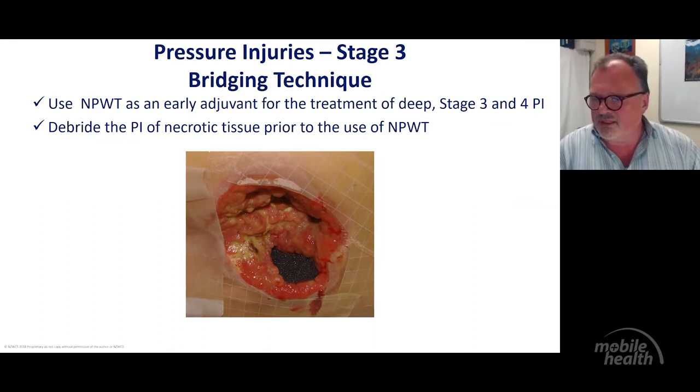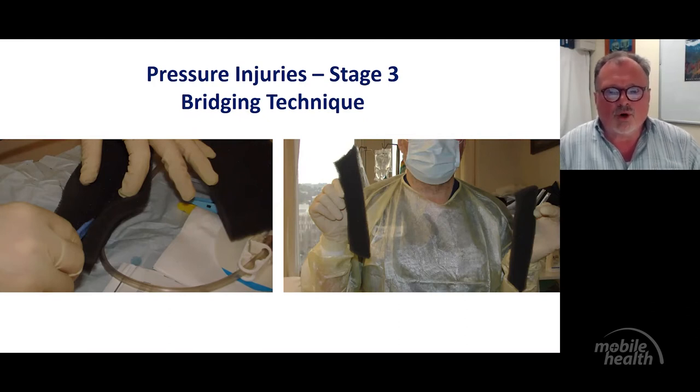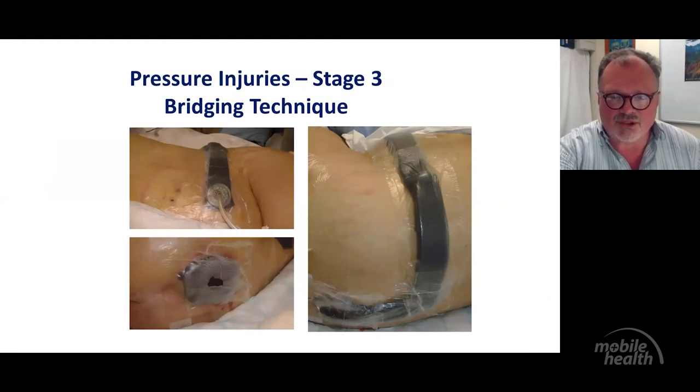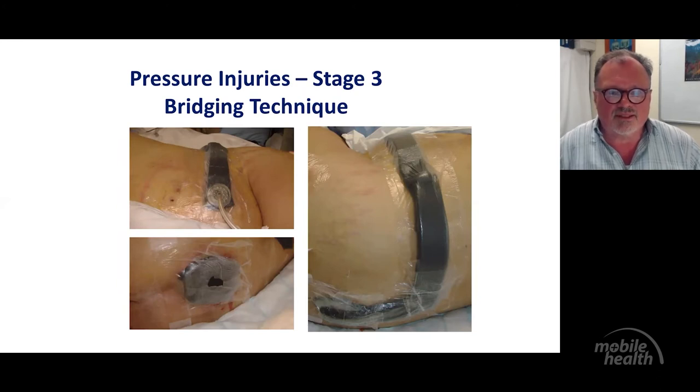So he developed nasty pressure injuries in several areas of his body. So I'll show you a bridging dressing technique, which we used to make sure that the tracking pad is not on the area where he's lying. So we cut those foam pieces. And that's where the patient has a pressure injury on the sacrum area. And we bridge it from the sacrum area right to the abdominal flank and have the tracking pad there.